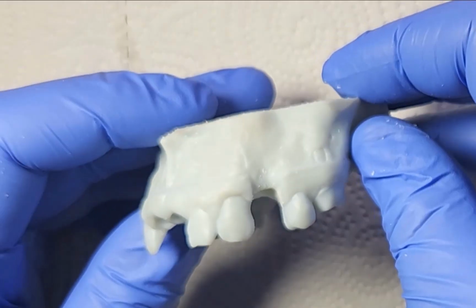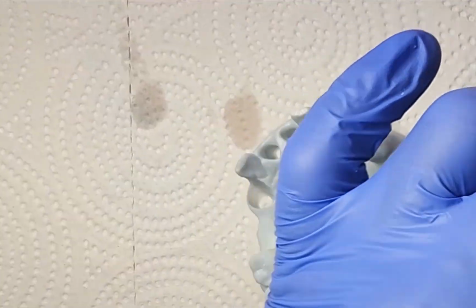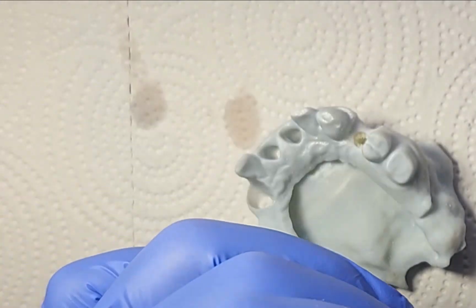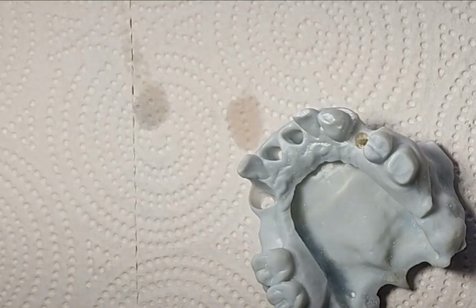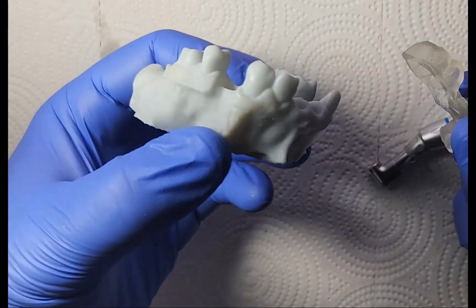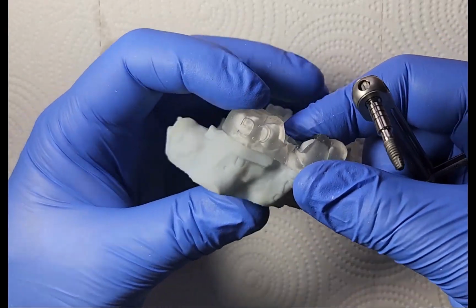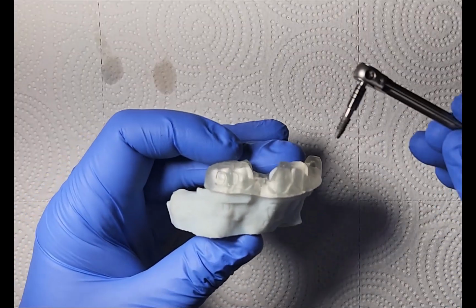And depending on how the bone felt, if this were a real patient, I might opt to undersize this, particularly in the maxilla. And given that this is foam inside of a 3D printed model, I'm also going to opt to undersize this. Make sure that there's no debris remaining, and then go ahead and take your implant out of the package. And so now we're ready to place the implant.